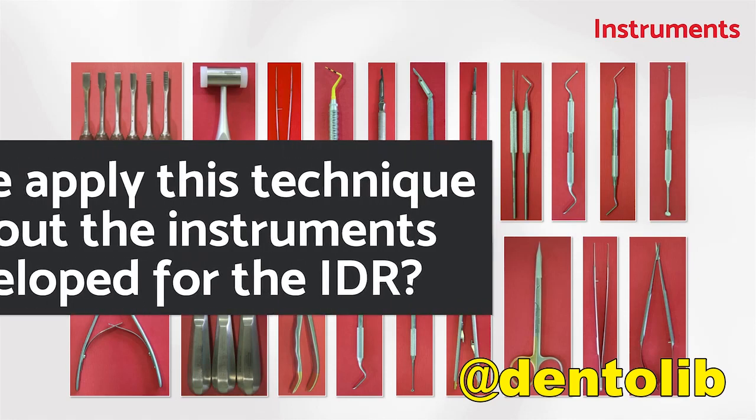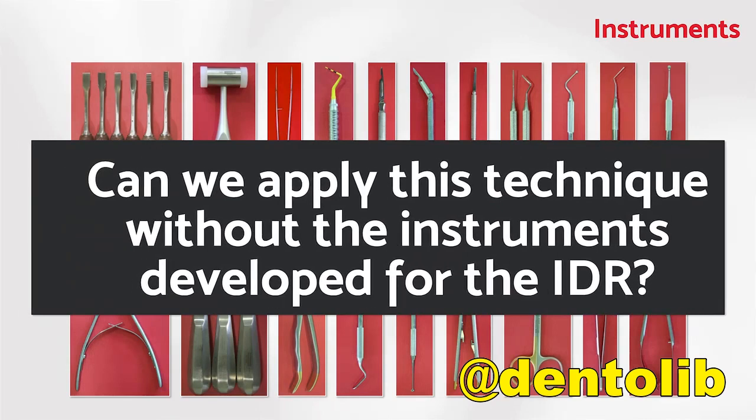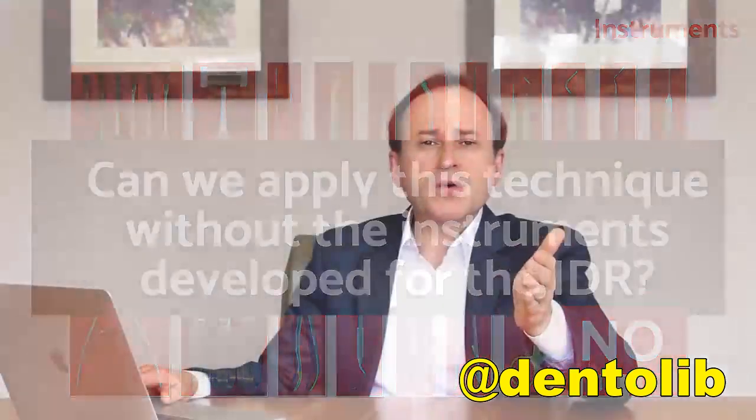But the question is, can we apply this technique without the right instruments developed for IDR? Of course not. There is a rule that you can obey, and one of the rules is to use the right instrument in order to take advantage of this bone to do the bone reconstruction in your patient's mouth.